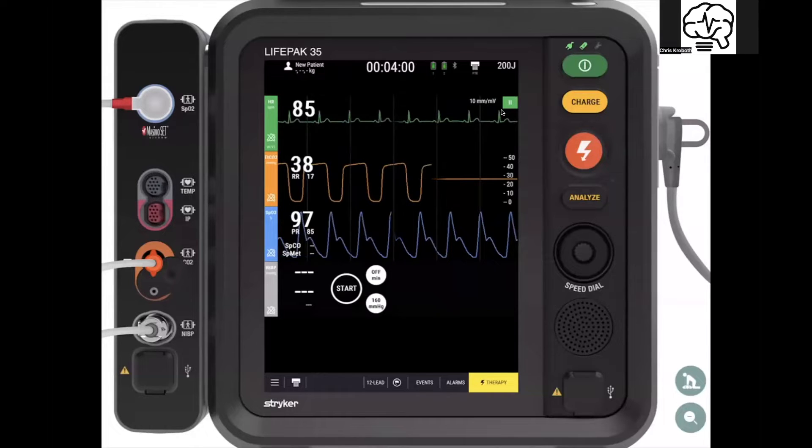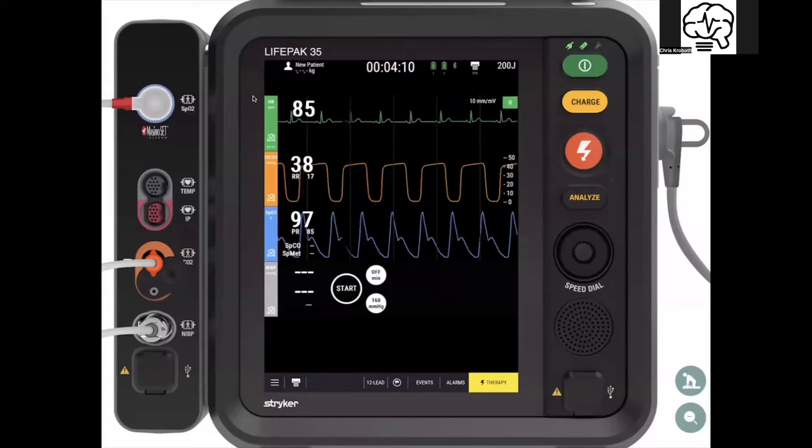Here you see the screen of the LifePack 35. One of the things right off the bat that's awesome about it is all of this center area — essentially anything that's screen is touchscreen. It's a durable touchscreen that works very well with your gloves on.